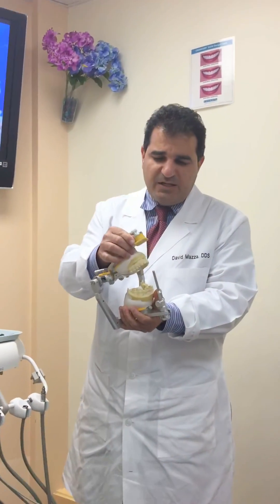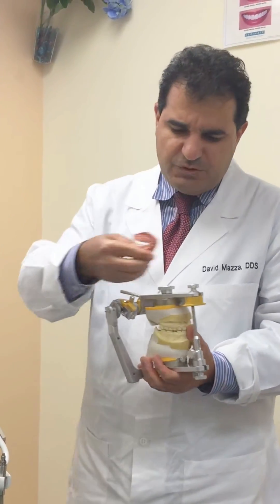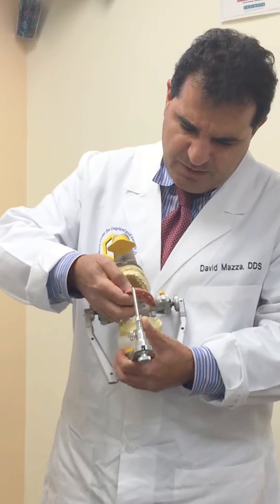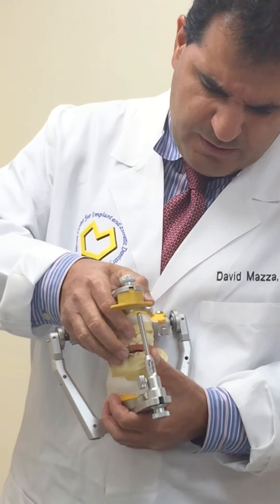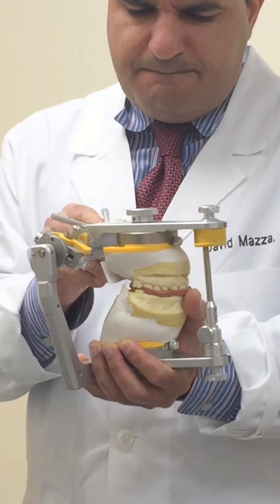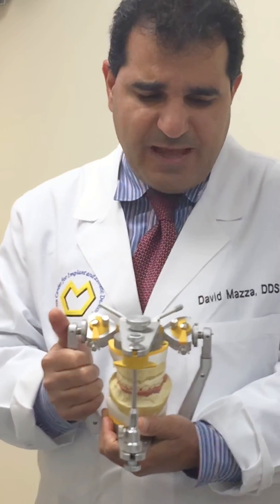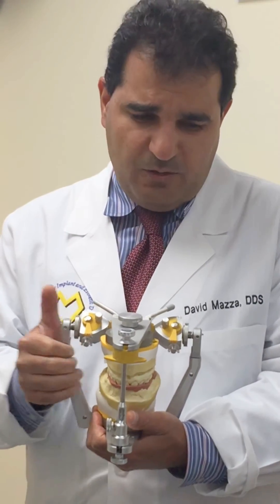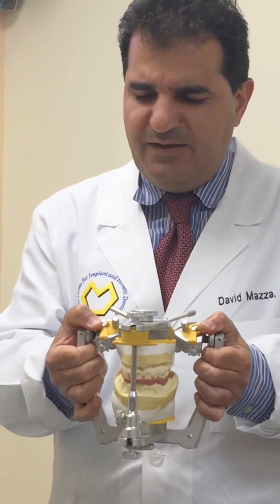This maxillary cast is mounted based on an ear bow or face bow transfer — an axiographic face bow transfer. To determine the inclinations and the Bennett Angle, I have a maximum intercuspal bite registration that is going to be placed, matching the maxillary arch and mandibular arch. We are going to be locking the centric locks at the right side and at the left side.